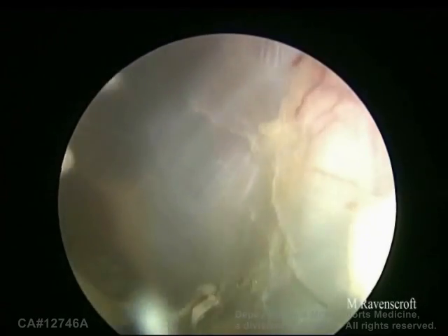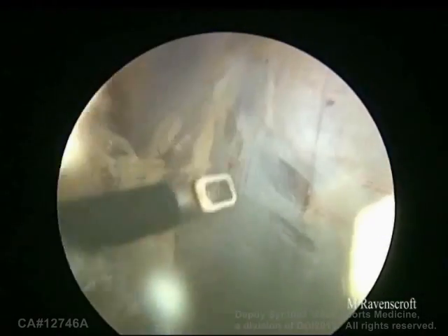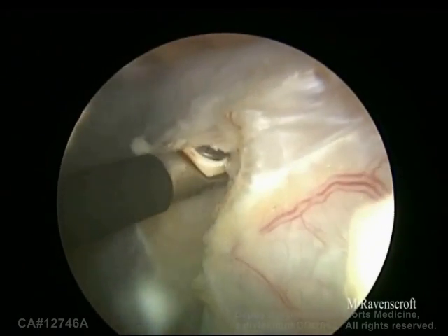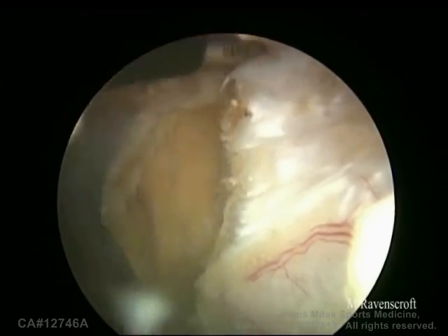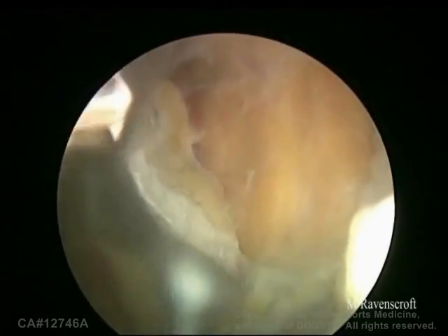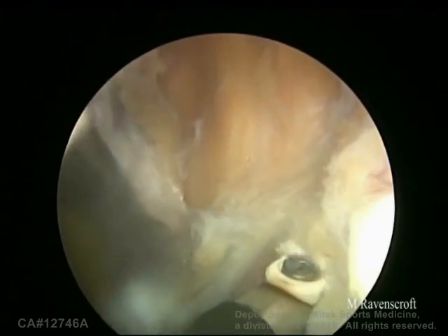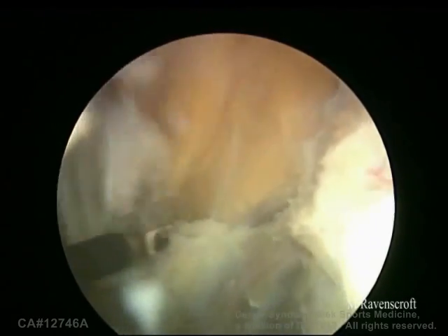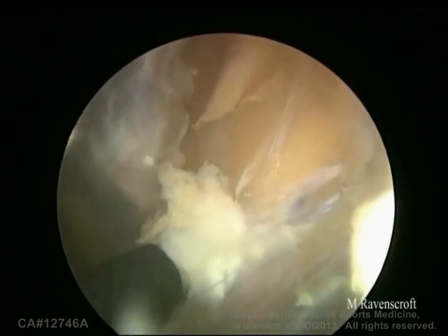Now we're going on to the pec minor release. For the pec minor release you can either view through D and work through J, or view through J and work through M. Here we're looking and viewing through J and working through the M portal, which often gives a better line of attack onto the coracoid process. So working from inferiorly up with the vapor pointing towards the coracoid and up — which is a safe way to use it as it's away from the brachial plexus — the pec minor should just release off. There's often a difficulty in finding the edge of the conjoint tendon and the start of the pec minor, but this medial side of the conjoint tendon needs to be mobile; if not, it won't fit through your subscap split.